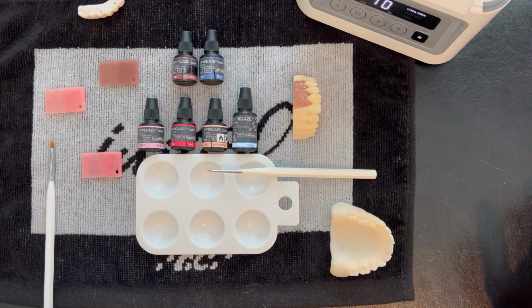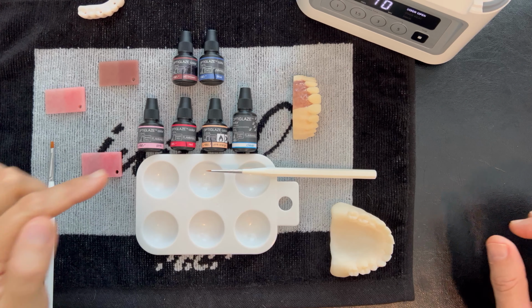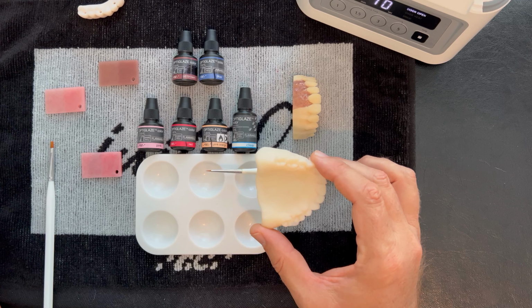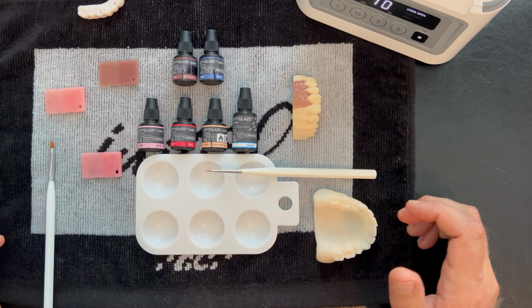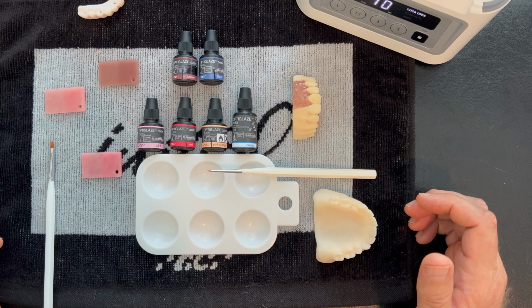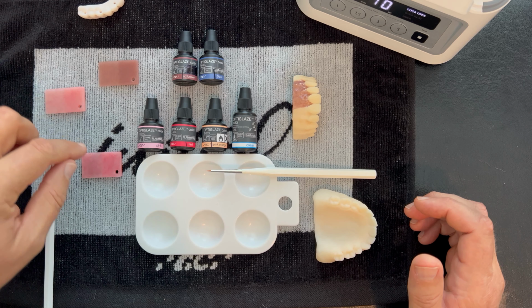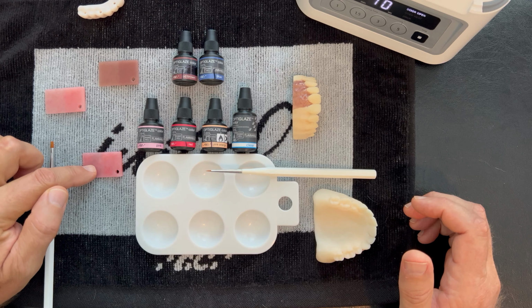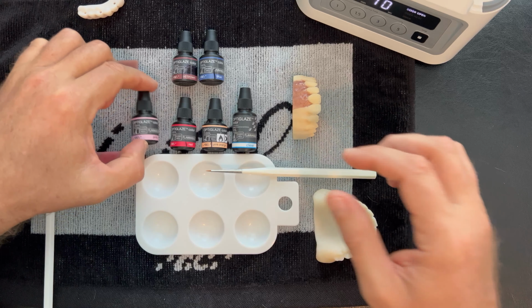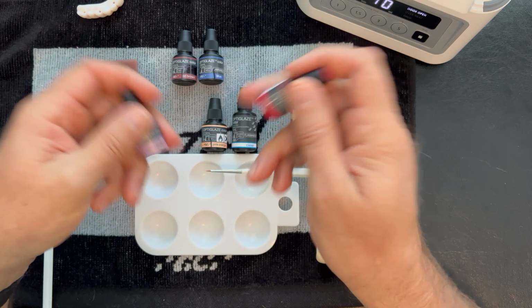Okay, this is a quick video to show you how to use Optiglaze color on your print materials in order to do a quick and easy tissue colorization and come as close as possible, in a lot of cases dead on match, to some of our popular super high impact nature acrylic shades. We're going to do shade 35 here. We're simply going to use pink and red.